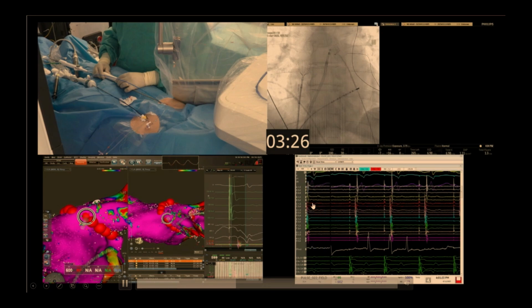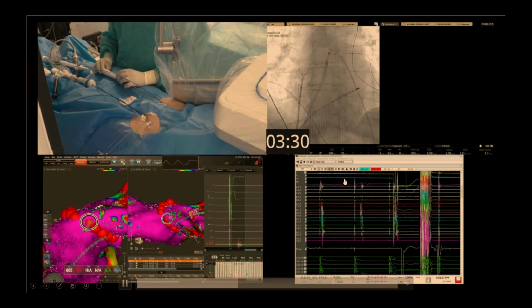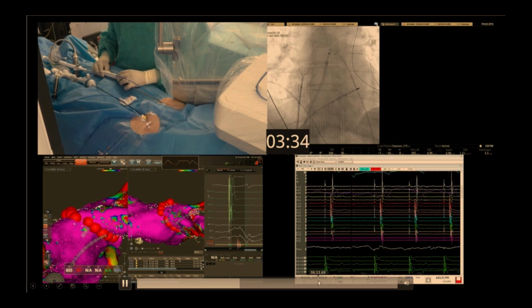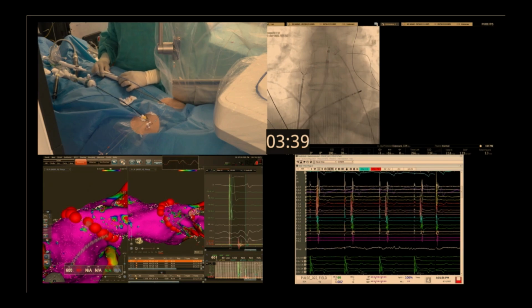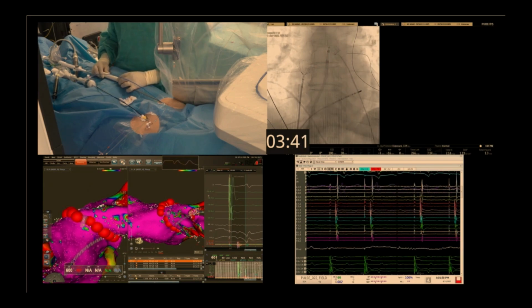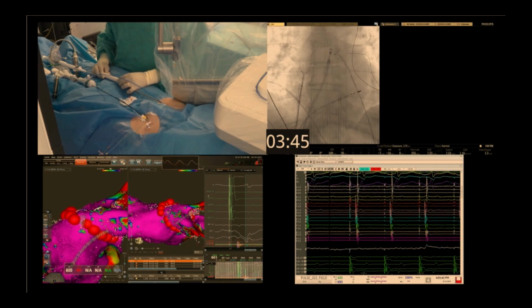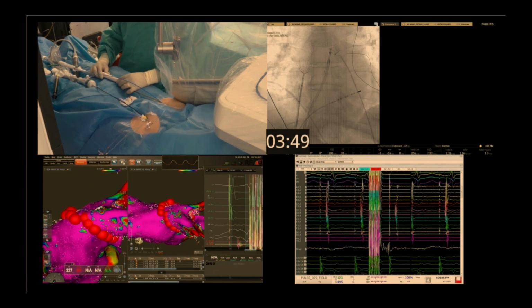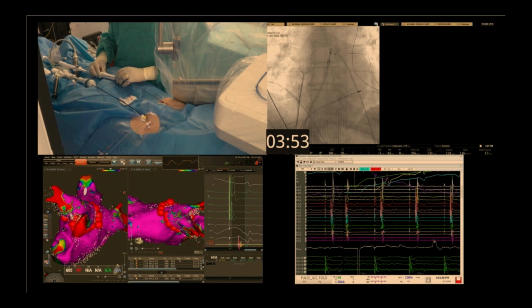But from a safety assessment, I guess we didn't show the ICE on this one. I don't know if you noticed the ICE image in the previous case, and we'll see it more when I go back. With each application, you do see a burst of microbubbles. It's a veritable hurricane of microbubbles. Electrolysis. Yeah, and we believe it's all electrolysis.